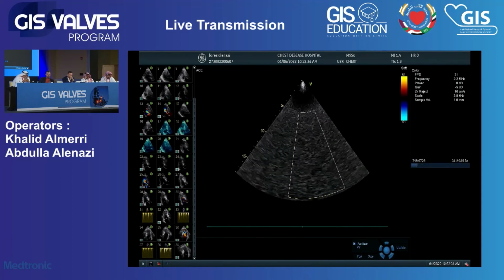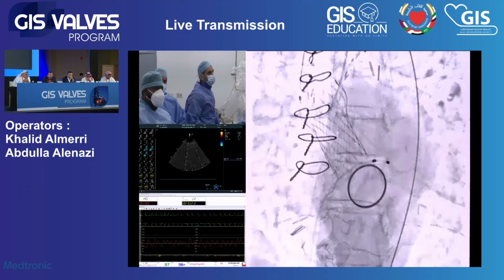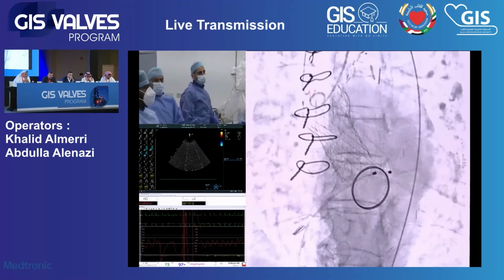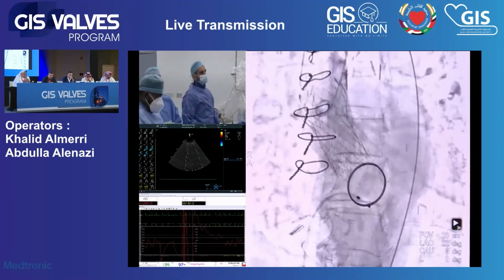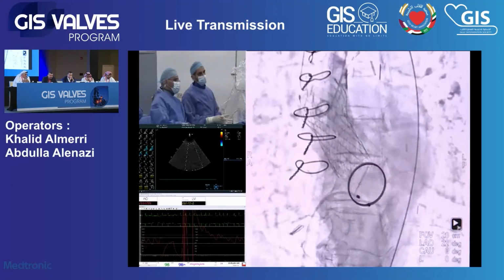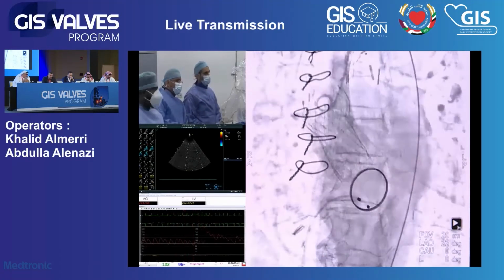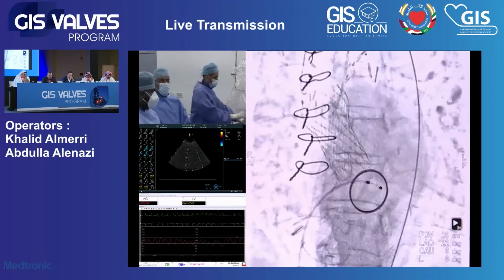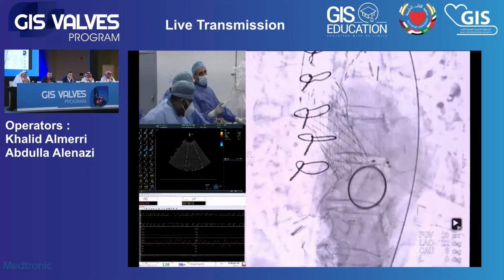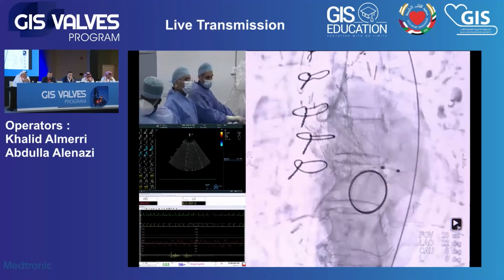We had an echocardiography, and there is trivial posterior aortic regurgitation, and you can see the angiography now with injection. The peak-to-peak gradient is less than 10 in the cath lab by hemodynamics, and the mean gradient is around 5 millimeters. So I think this is a nice, acceptable result. Yeah, I think another advantage we have from landing high is that there's no heart block or conduction delay.